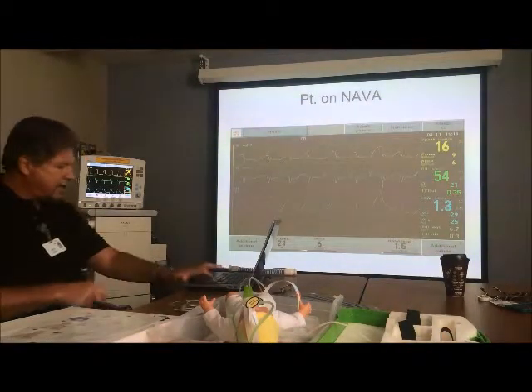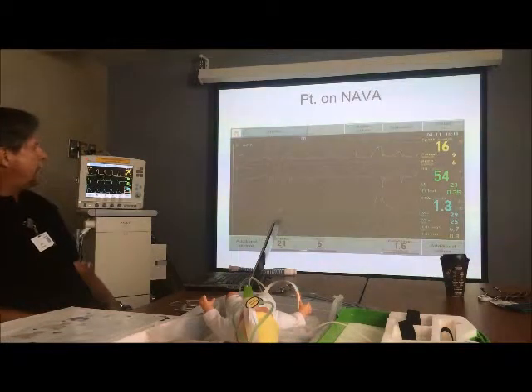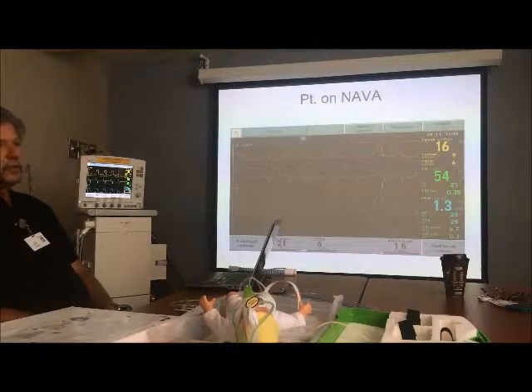He was already at, I think he was already at 21%. Yeah, he was already at 21%. But nonetheless, he's using less oxygen because he's not arguing with the ventilator as much.